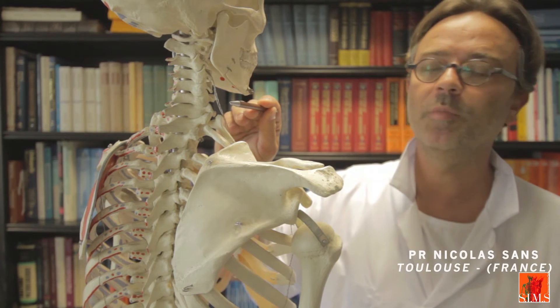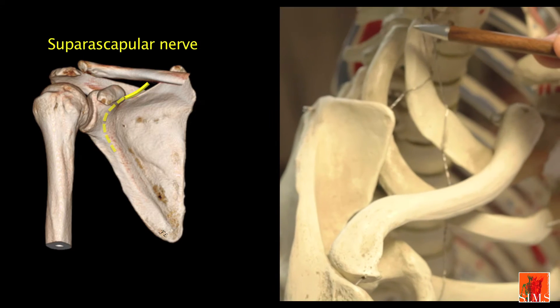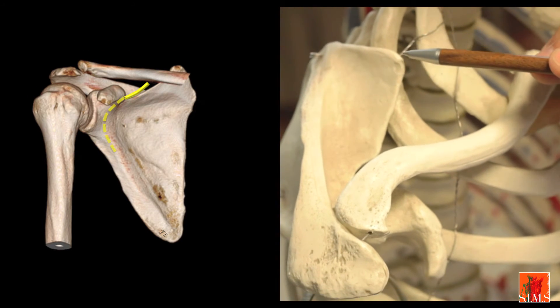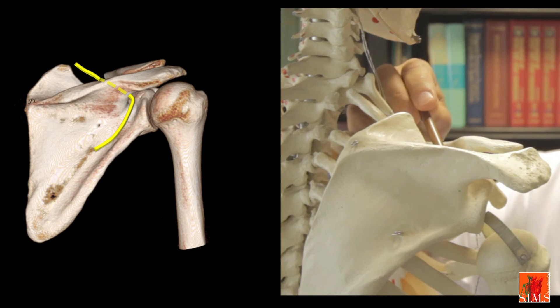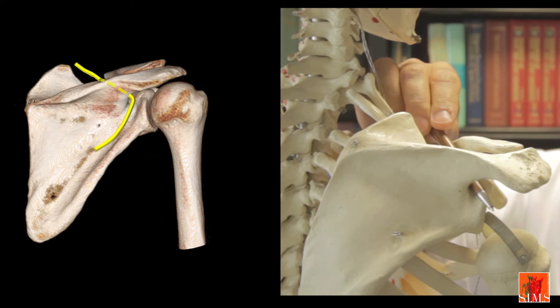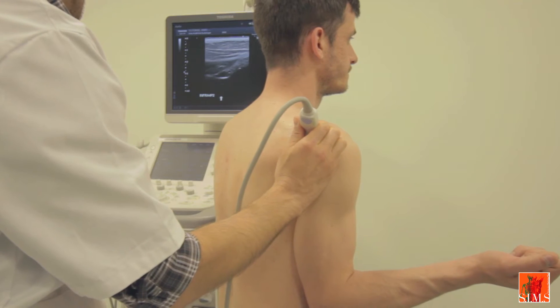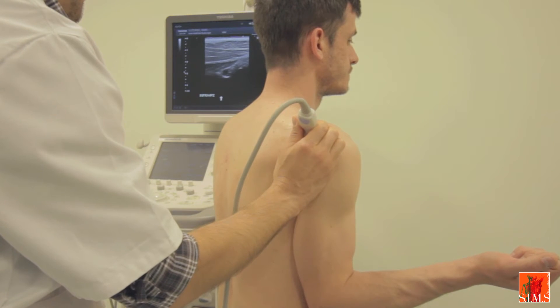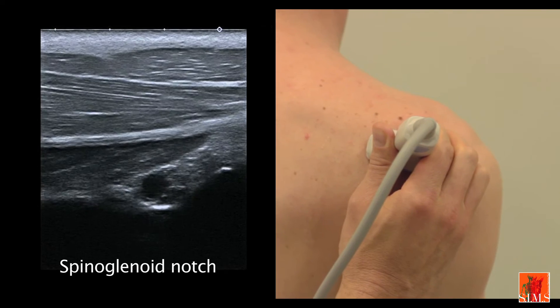The suprascapular nerve springs directly from the upper trunk of the brachial plexus. It then travels laterally along the deep surface of the trapezius, goes through the scapular notch and then the spinoglenoid notch onto the posterior aspect of the scapula. Let's revert in an axial plane to the spinoglenoid notch, where there is a vein of which the terminal branch of the suprascapular nerve is a satellite.